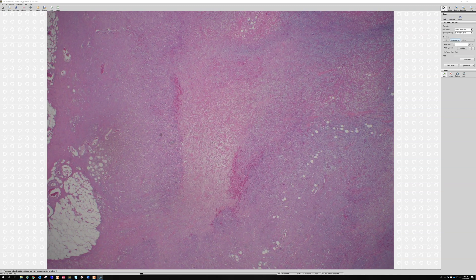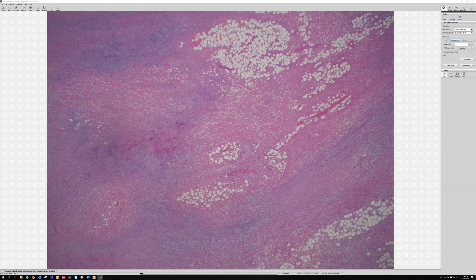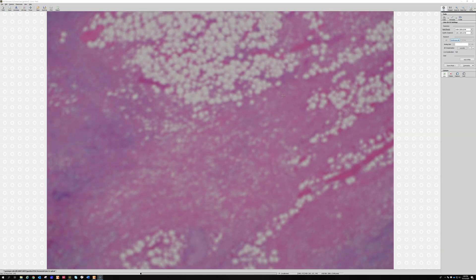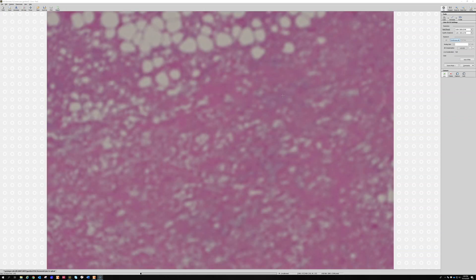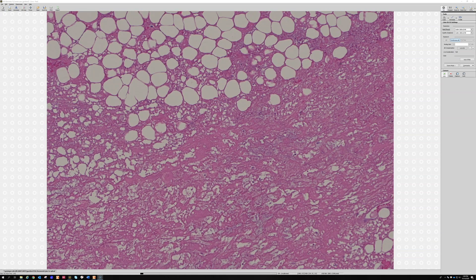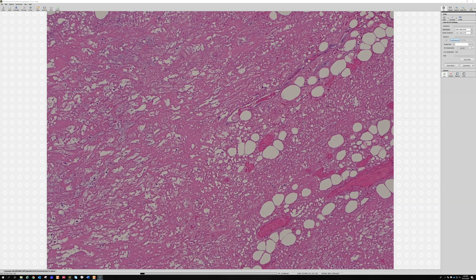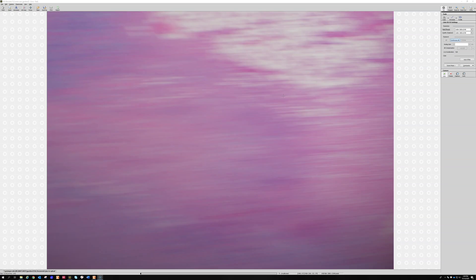When we go to the center of the lesion, something different happens. In the very middle, there's a zone that's not bluish and myxoid anymore but red. Going closer, it's all dead — it's necrosis. But it also looks kind of like fibrin, so we call this fibrinoid necrosis. It's a necrosis where there's been bleeding into it, so it has that bright red color of fibrin but all the tissue is dead — a fibrin-necrosis overlap.